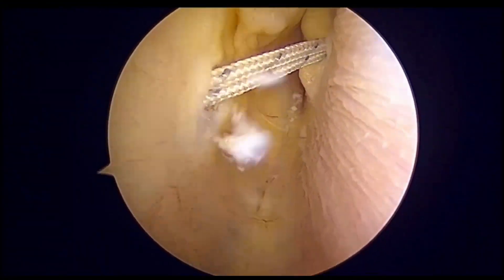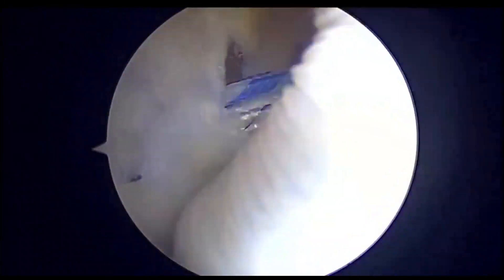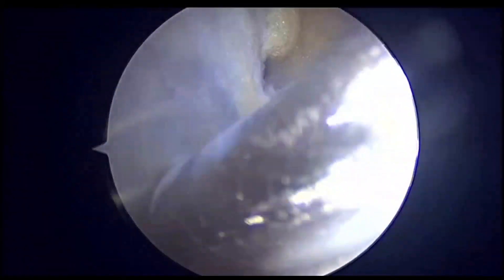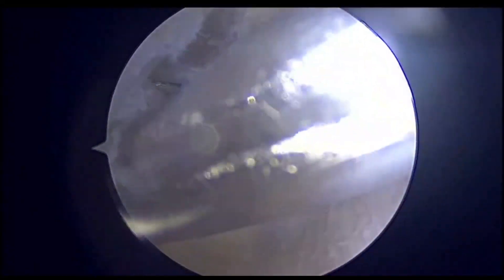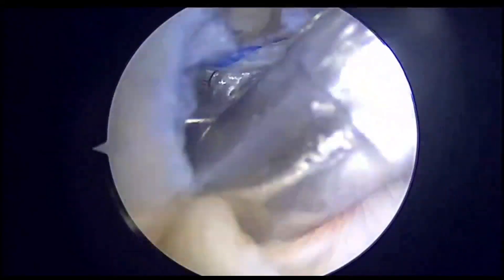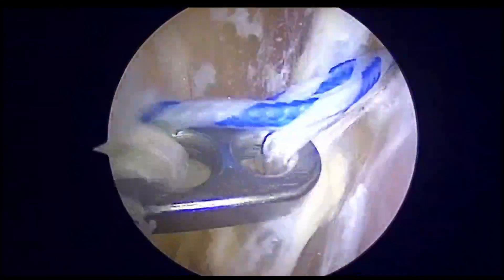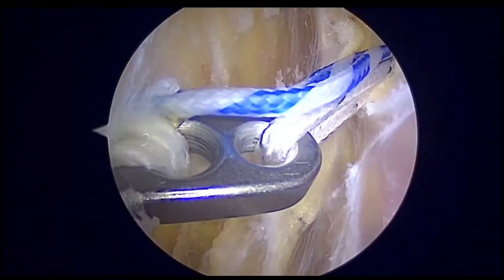Ecobuton Flex is an innovative hybrid loop used for ACL surgery. Here we are showing how Ecobuton Flex can be used and visualized under arthroscopic vision on the lateral aspect. We are preparing the tunnel exit on the lateral parapatellar recess, and here we can see the button coming into picture.